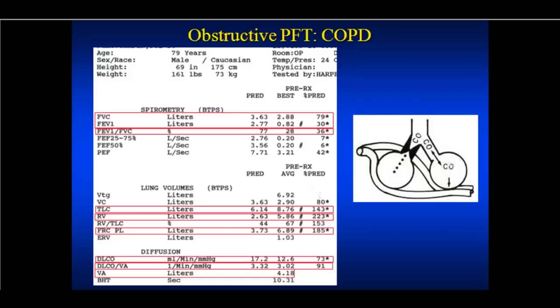So in this case, the DLCO does correct for alveolar volume, but it's very different from someone who's got very small lungs in very small space to distribute gas. What's happened here, this person is air trapping to beat the band. There's an area of lung that doesn't see much air movement at all. So during that 10-second breath hold, in relative terms, that methane went into a very small space relative to the entire space of the lung.